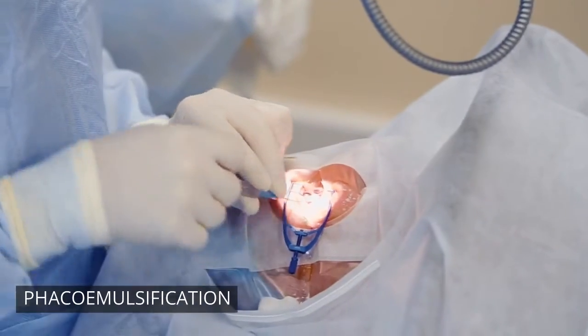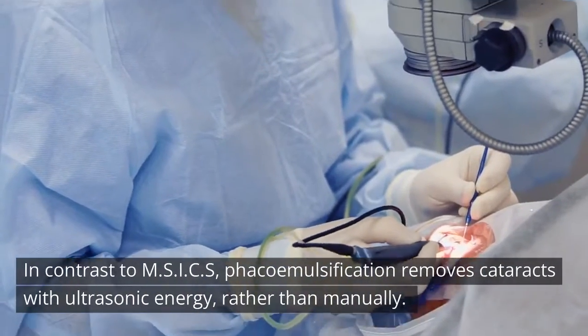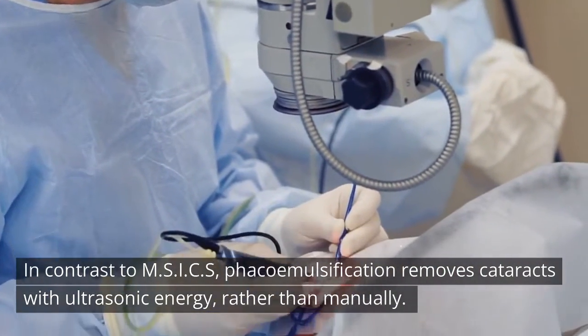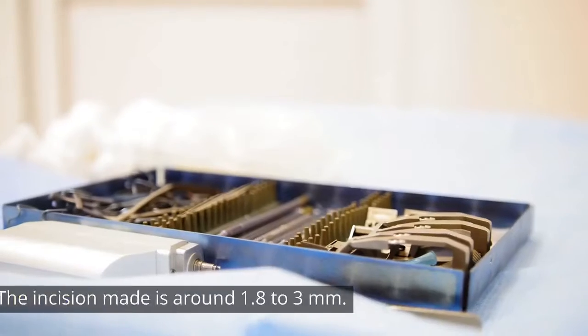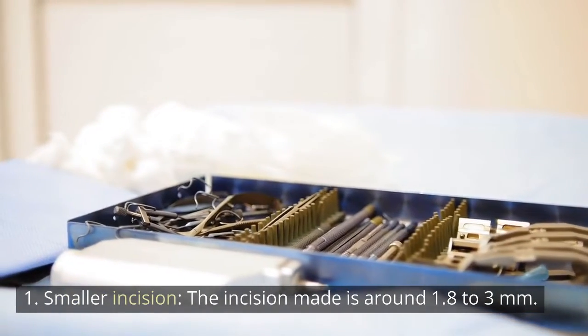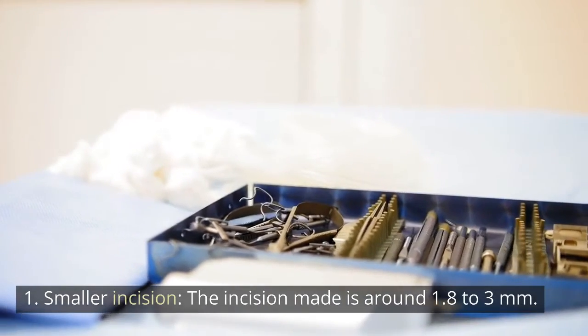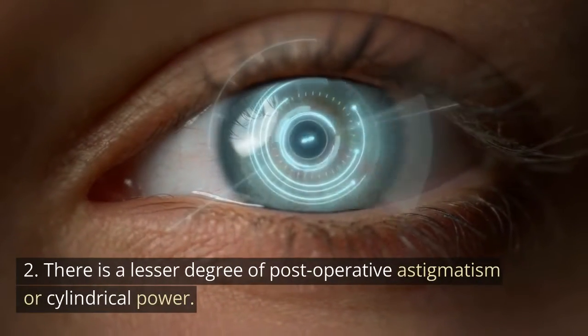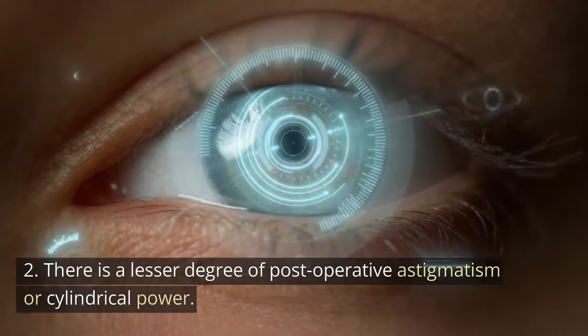Phaco emulsification. In contrast to MSICS, phaco emulsification removes cataracts with ultrasonic energy, rather than manually. Advantages include: 1. Smaller incision. The incision made is around 1.8 to 3 mm. 2. There is a lesser degree of post-operative astigmatism or cylindrical power.